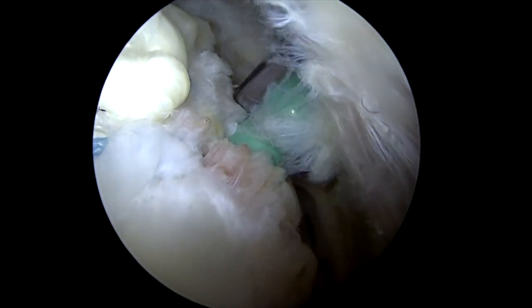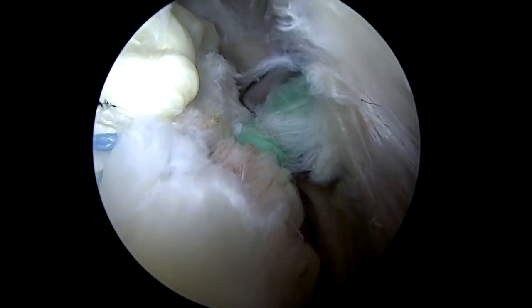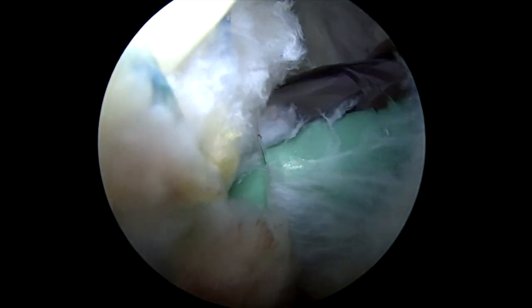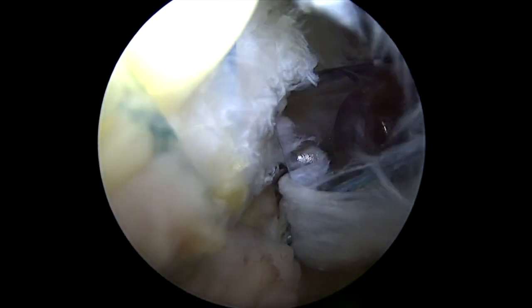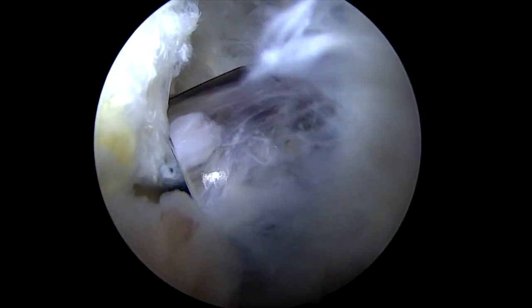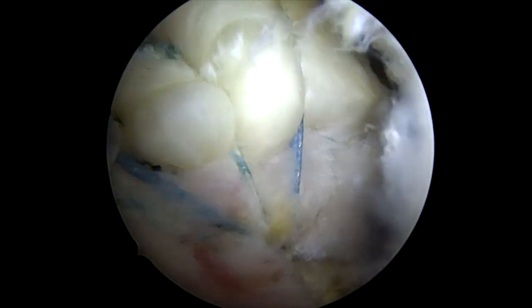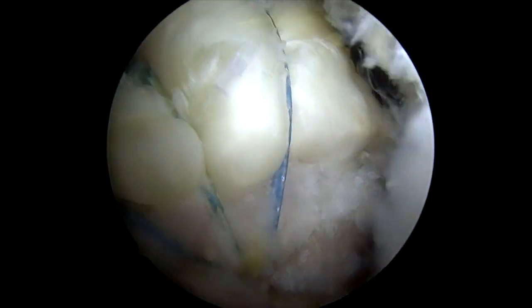One of the things we'll do here is I like to make sure this anchor is perfectly placed. You'll see us back up the inserter a little bit here, and then I'll look down and see it needs to go in just a little bit farther. So we'll screw that anchor in just a little bit farther to make sure that it's perfect. Then we can remove the inserter for the anchor and cut the suture tails that are coming out right here. And that'll complete our rotator cuff repair — you can see there, the tendon is nicely compressed down against the bone all the way across its footprint.